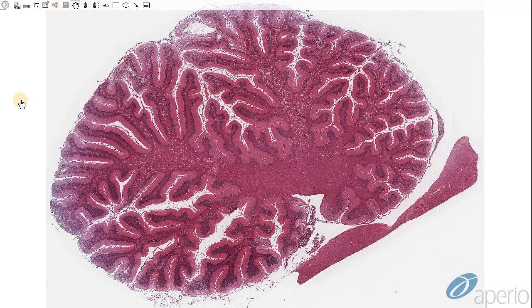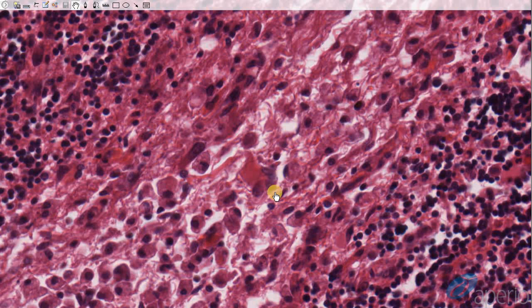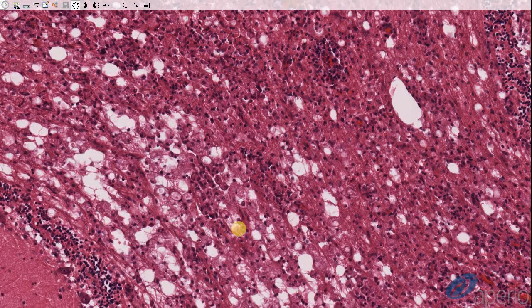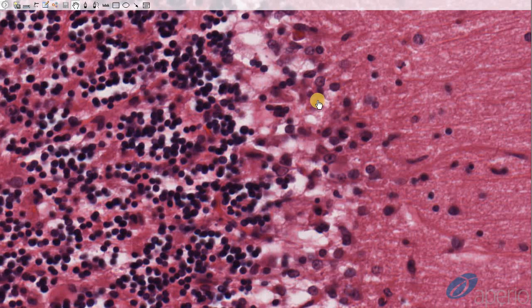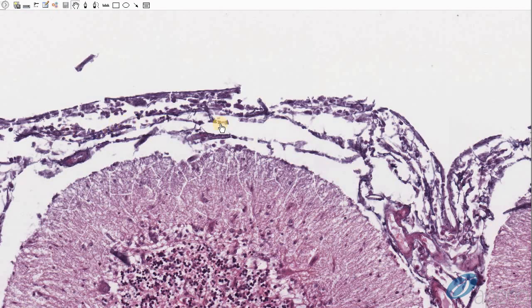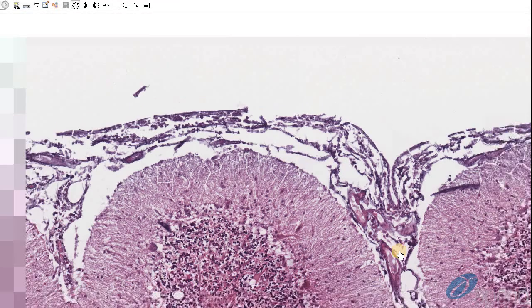This is a case of canine distemper meningoencephalitis in a sheepdog. At low magnification, we can see areas of vacuolation in the white matter associated with demyelination. Just like in other organs, we expect to see intranuclear and intracytoplasmic inclusion bodies, as well as viral syncytial cells. Here is an example of viral syncytia containing three nuclei. The area of demyelination shows multiple spheroid formations, occasional intranuclear inclusions, and eosinophilic cytoplasmic inclusions. The meninges are also inflamed, hence it is considered meningoencephalitis.